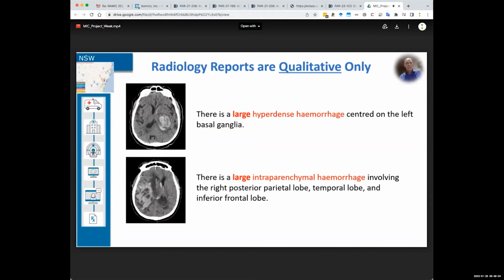I have spent many hundreds or thousands of hours outlining these lesions through my career as part of my research efforts, and I've trained countless students and trainees to do the same thing, but we simply can't keep up with the clinical workload. And it's been a dream of mine to have those clinical tools and my research tools come together.